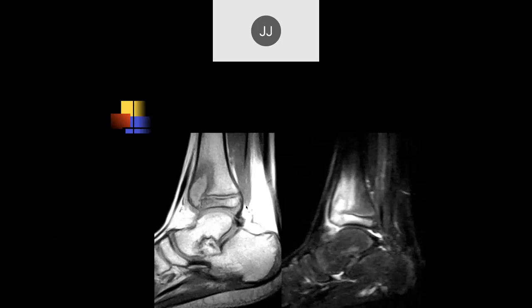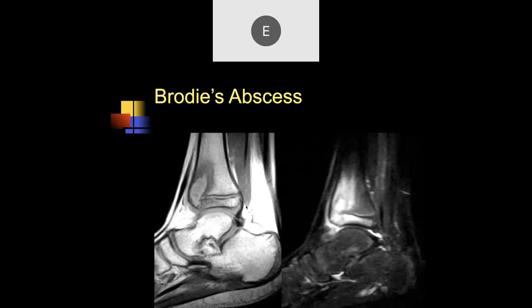Looking at the anterior distal tibia of a young pediatric patient — note the open growth plates — there's a fluid collection involving the metaphysis extending to the epiphysis; I'd be concerned about an abscess. This is a classic Brodie's abscess. Usually due to bacteremia where bacteria get dislodged in a small arteriole in the metaphysis near the growth plate. If allowed long enough, it'll go through the growth plate cartilage and extend into the epiphysis, as we see here — you'd like to pick these up earlier.